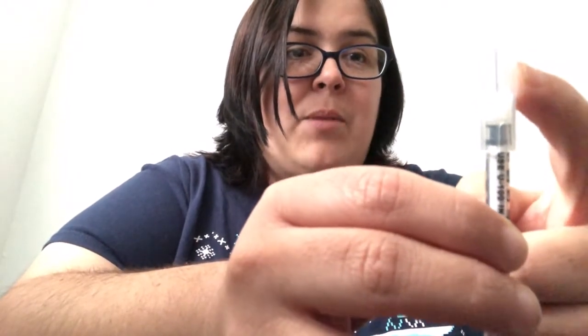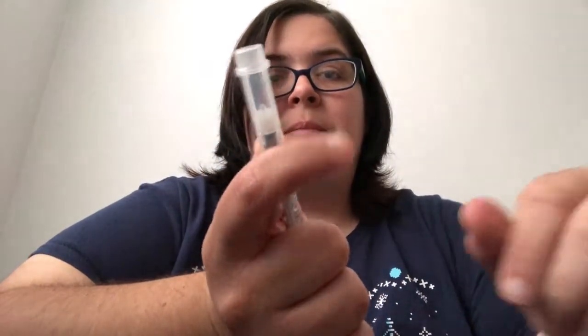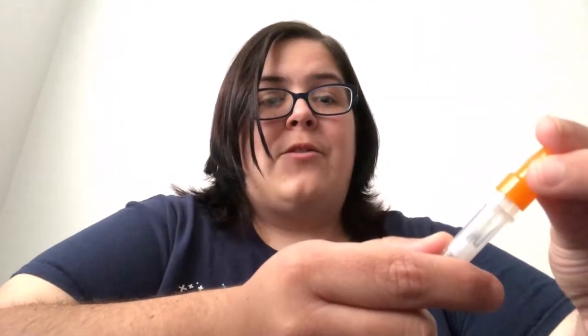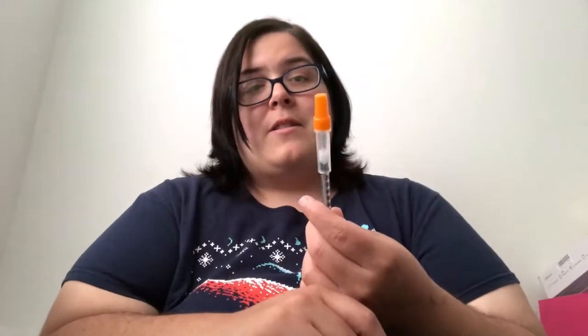It's inside the plastic. Now, this will come back down, so you need to be careful. After you push it up like that, dispose of it. Put it in the sharps. I've known people who have tried to cap this, which you can do. Sorry about that. You can recap this, but I wouldn't.